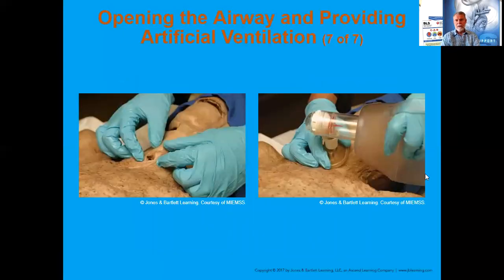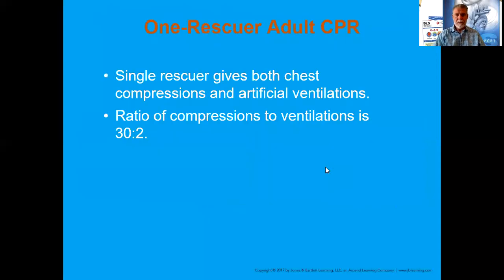But here's the illustration. Notice this is most likely a pediatric mask, because I tried it with mine. I was like, okay, I'm going to give myself a stoma, and then I'm going to see if I can actually ventilate that. But size-wise, it just doesn't fit well. So that's why, if you look at this slide, it does appear that he's using a pediatric mask, because a stoma opening is quite small, and I don't want to use that larger mask, which really isn't going to fit over that space.